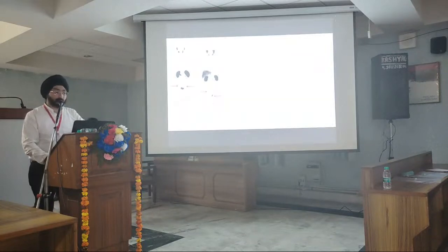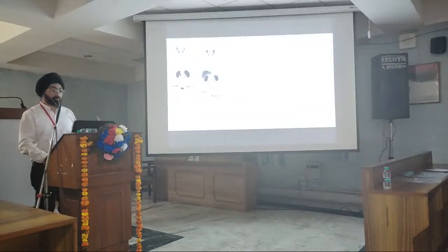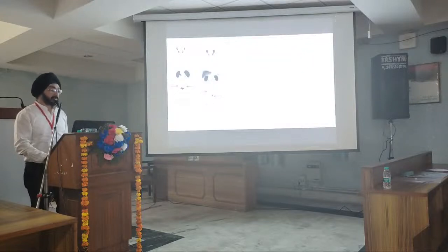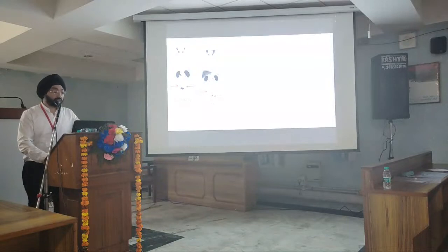These are the two most commonly used PSMA radiotracers in India. One is gallium PSMA 11 or F18 PSMA 1007. The commercially available one is this F18 PSMA 1007, which is available just like FDG is available. It does not have renal excretion, so it gives us an inherent benefit that the urinary bladder activity is not there, and the prostatic lesion can be identified more easily as compared to the gallium PSMA, in which there is excretory activity in the urinary bladder.